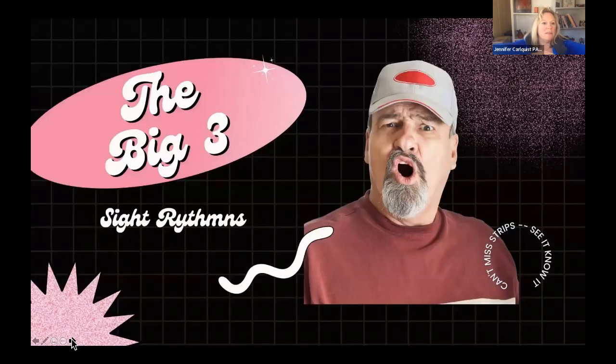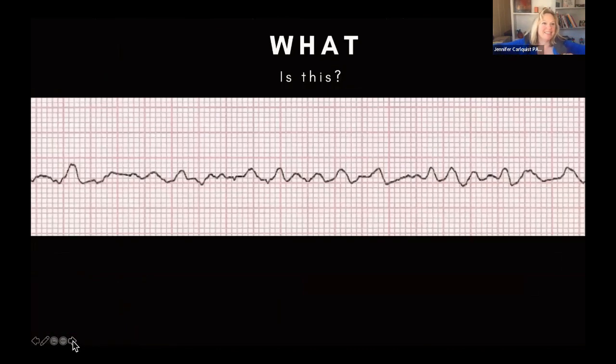So then there's this concept that with sight rhythms, there are 3 rhythms that you should know by sight right off the bat. And these are called the big 3. So there are can't-miss strips. You have to see it, shout it out, and know it. So we're going to do a little pop quiz for you guys. All right. So ready, set, go. What's this one?